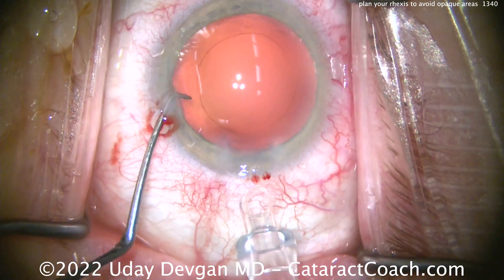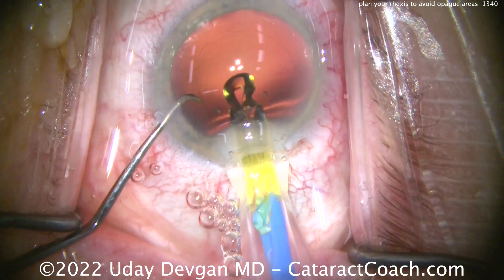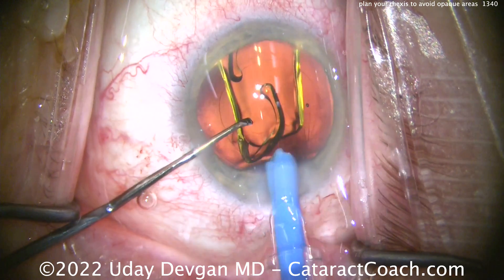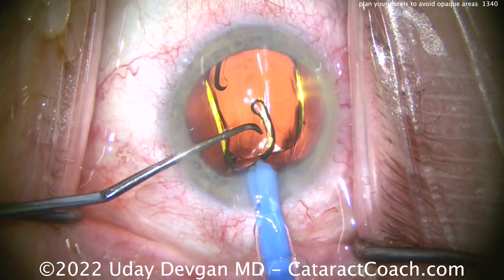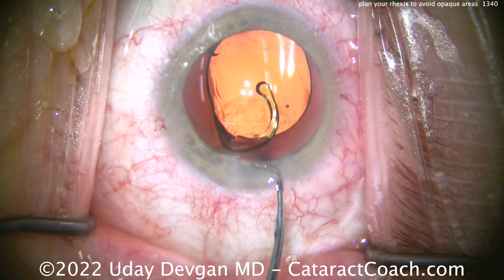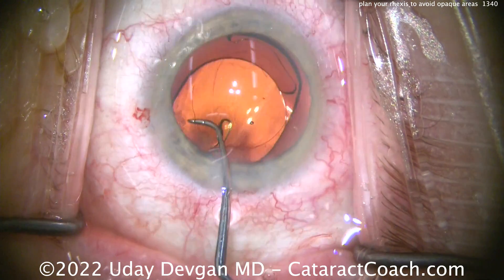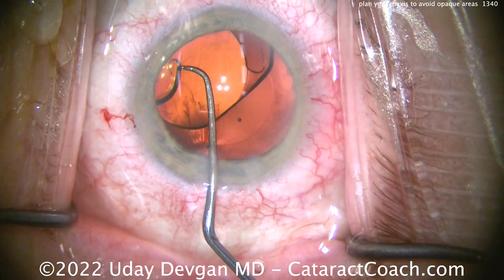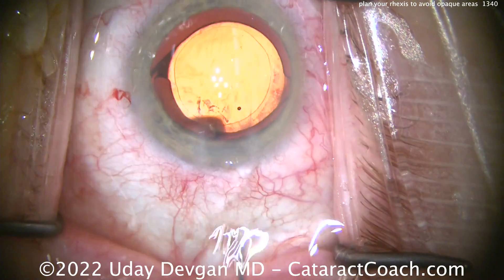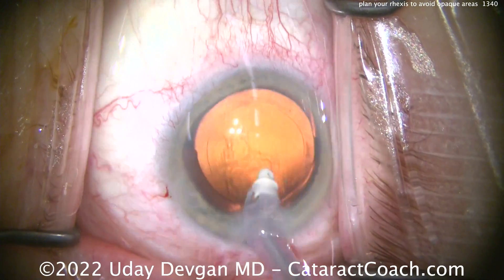If the patient has a 4.5 mm dilation on the pupil, I can do a 5 to 5.5 mm rhexis without directly visualizing that edge — you know where it is. This is something very similar. We keep the highest margin of safety by only letting go of the capsule and regrabbing it in an area where we still have a reasonable degree of visualization. There's the lens in good position, and you can see we're using that 6 mm optic to judge our rhexis size — it looks pretty darn good, probably a 5 to 5.5 mm rhexis, exactly what we wanted.